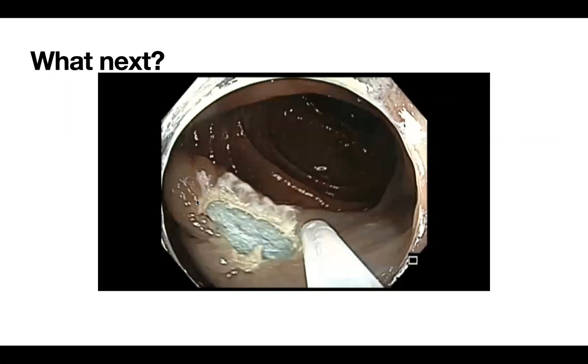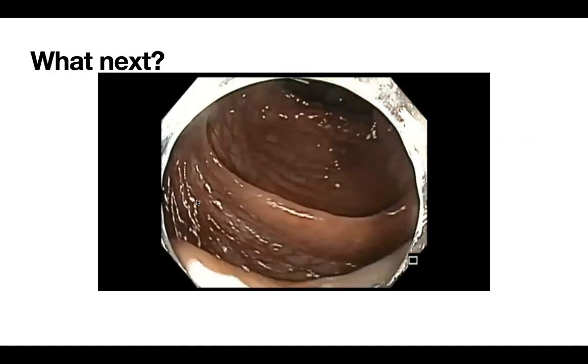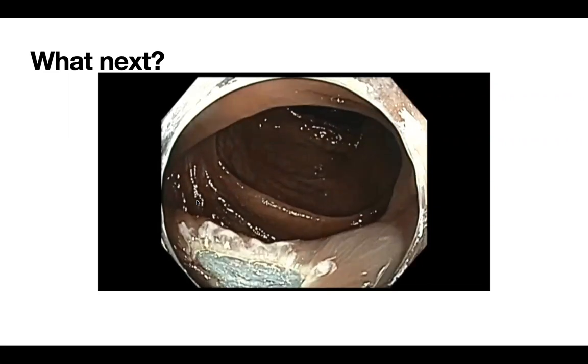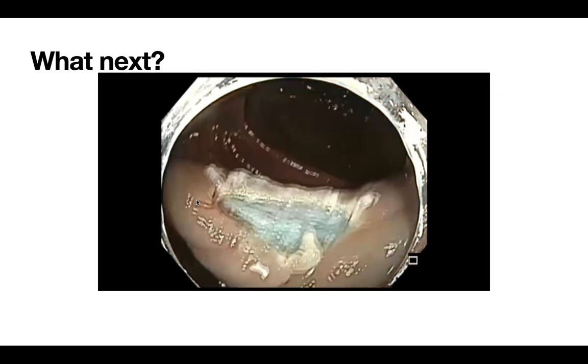So let me ask Zubair to comment on where is the level of the resection? I think it's just above the submucosa. Yeah, it is in the submucosa.